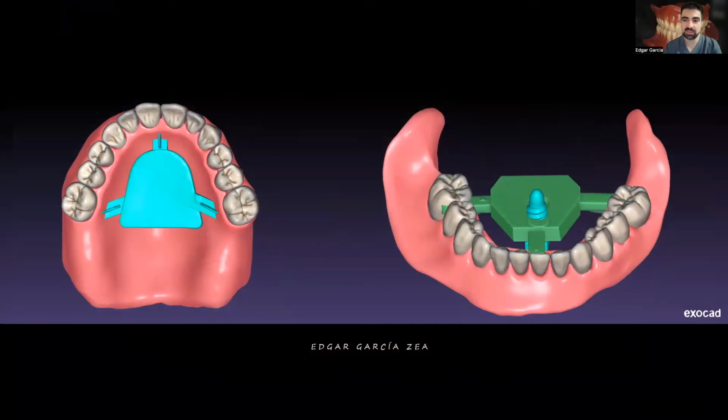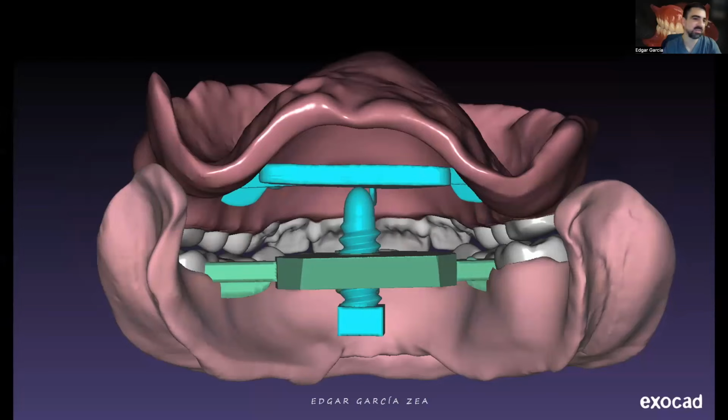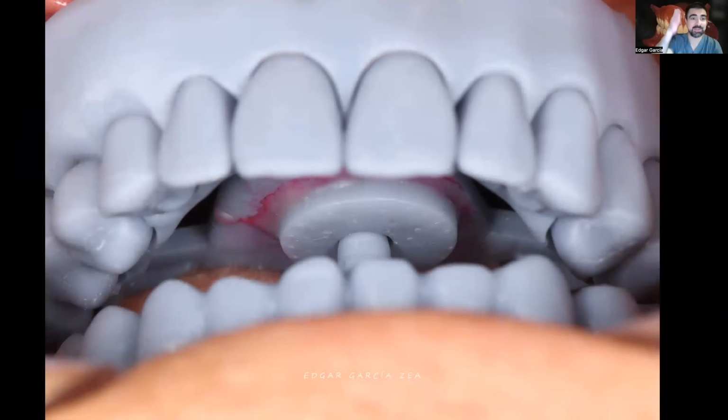I used to paint this flat plate with pasta rosa. Is that like articulating paper? Something like that. Exactly. And I made the patient do movements from right to left, forward, and the tracing, the markings. Exactly, the point where they intersect.